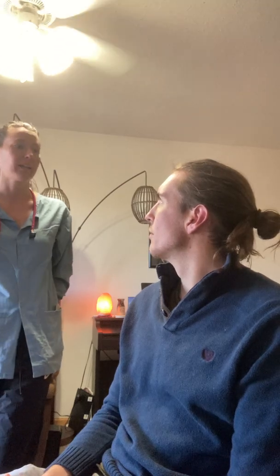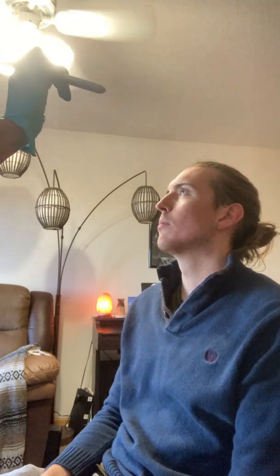Okay, we're gonna just do an eye exam and an ear exam, and we're gonna look at all of your external structures and your internal structures. All right, we'll go ahead and get started. I'm going to start by looking at your corneal light reflex. So I will have you look at my nose, and then I'm gonna shine my light here onto your eyes, and I'm noting that the white light reflex on your pupil is equal symmetrically and bilaterally. So your extraocular function is intact.